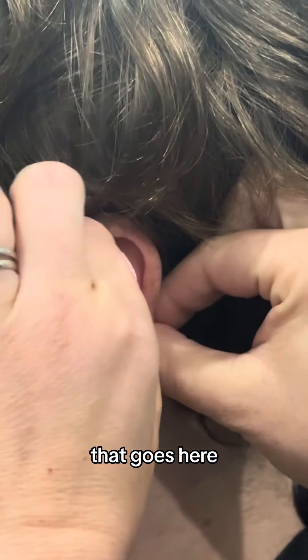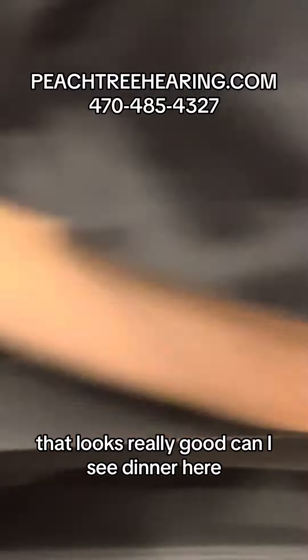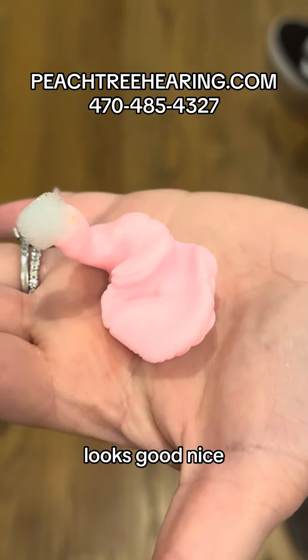That goes here. I'm just going to twist. That is a gorgeous impression right there — that looks really good. Can I see it in your hand? Of course. Now everybody wants to see that part. Looks good, nice.